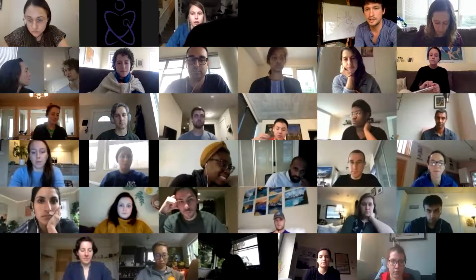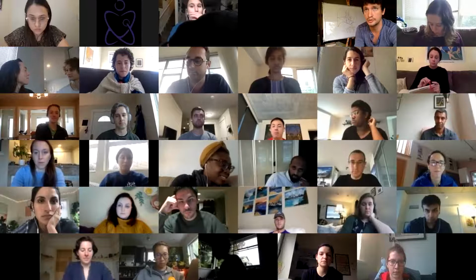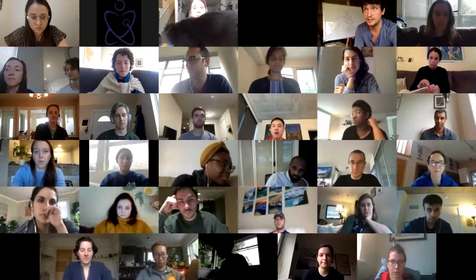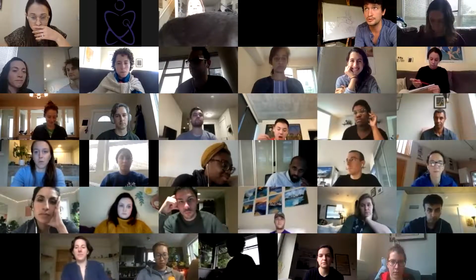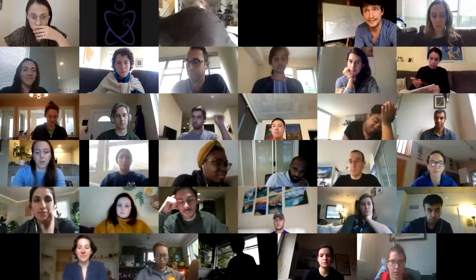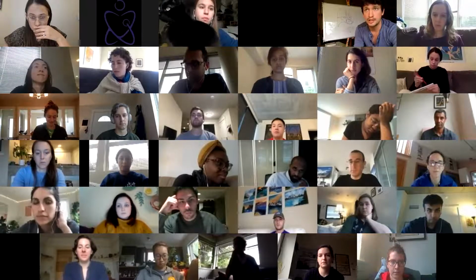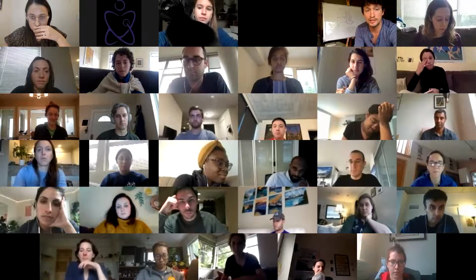Great. And I think that you bring up a really good point that I want to get across to everyone. I think the ABCDE method is perfect. Kevin did a great job of going through that. Some people like to add the acronym DOCTORS to the ABCDE method, with D being details, which is what Kevin went through. Making sure you got the right patient, making sure you know what view it is in.